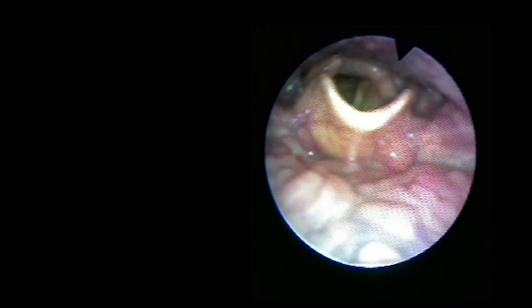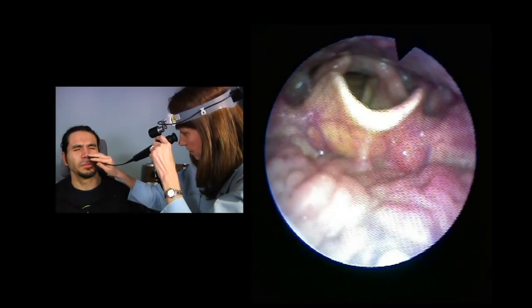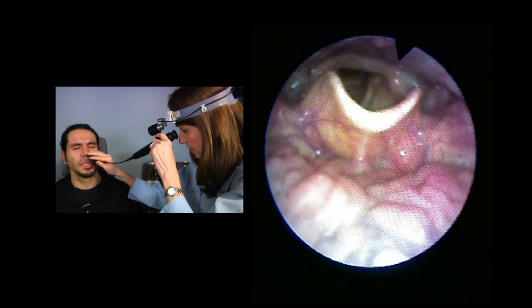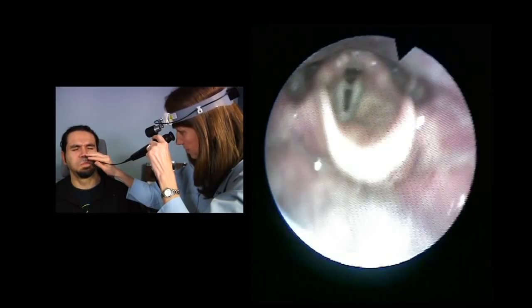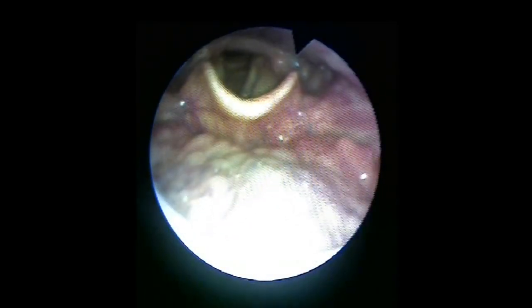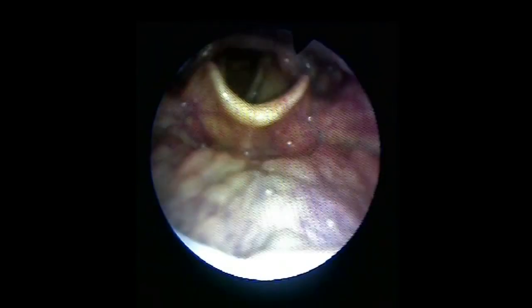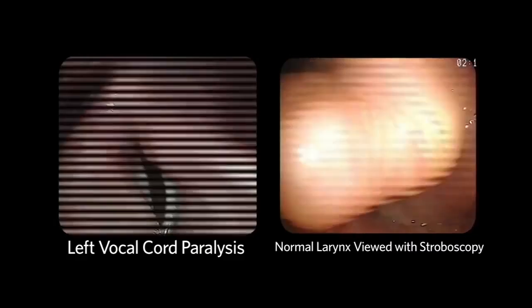Vocal cord mobility is assessed by having the patient protrude their tongue for evaluation of the vallecula, phonate E, hold nose, puff out cheeks, and alternate sniffs to evaluate the piriform sinuses, which sit lateral to the vocal cords. Vocal cord mobility is normally symmetric bilaterally and full in both abduction and adduction. Any weakness or asymmetry of vocal cord mobility should be noted. Vocal cord paralysis is a common pathology seen.